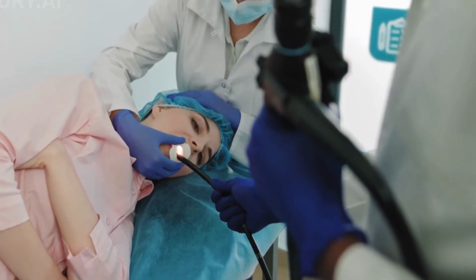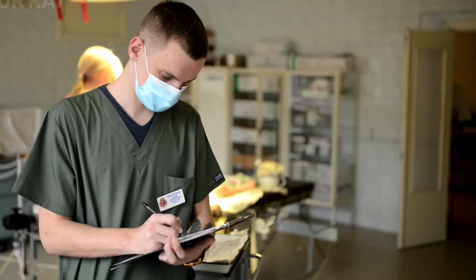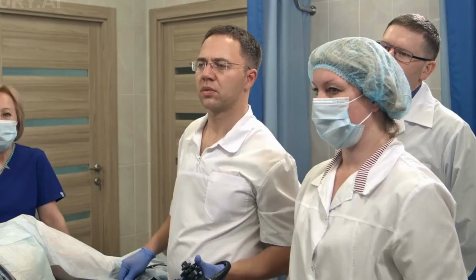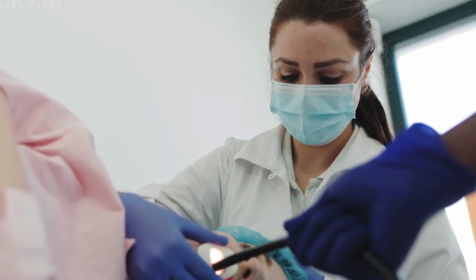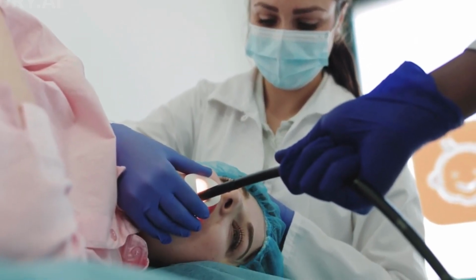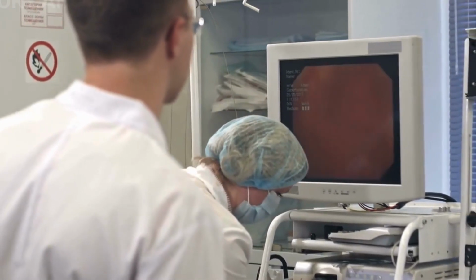5. Completion. Once the procedure is completed, the endoscope is slowly withdrawn. The patient is monitored as the sedation wears off, and most can return home the same day. Risks and complications of endoscopic procedures. While endoscopic procedures are generally safe, like all medical interventions, they carry some risks and potential complications. It's essential for patients to be aware of these before undergoing the procedure.